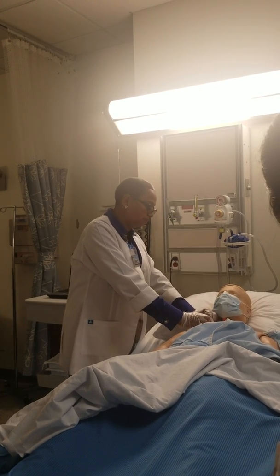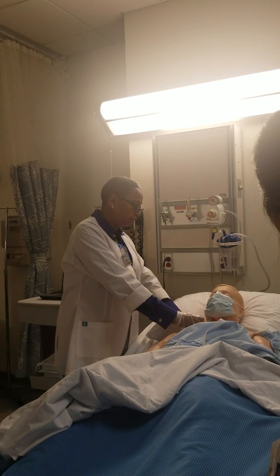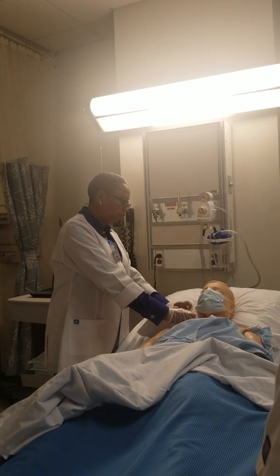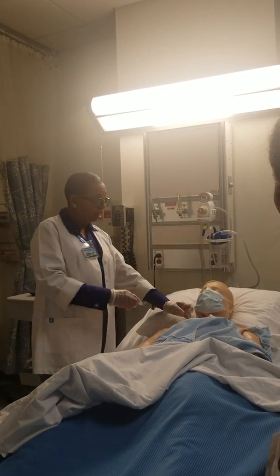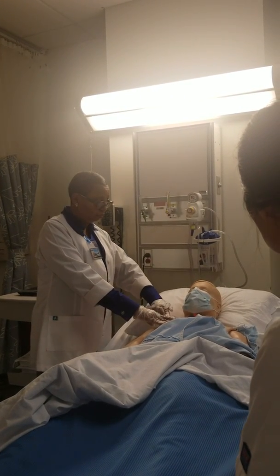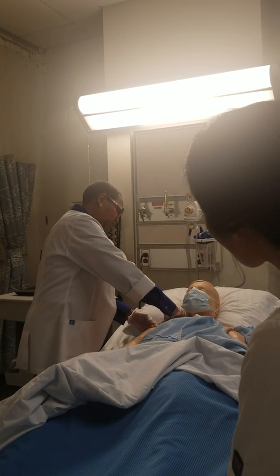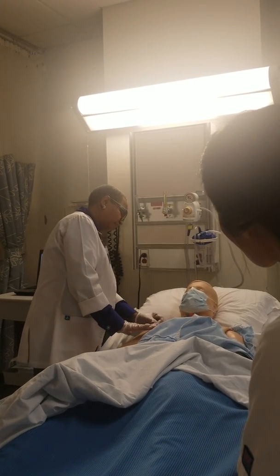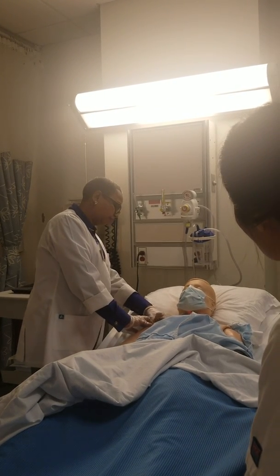So we've got to get this off. Now, you might have a little bit of a problem trying to do this, but I usually roll this back. What does it say on the sheet? Pull it toward the line. And the reason you're doing it is rolling it back this way. Why? You don't want to pull it out. So you need to expose it. It takes quite a bit sometimes to loosen up. Sometimes you have to use an alcohol wipe to do it. And hold on to this right here.